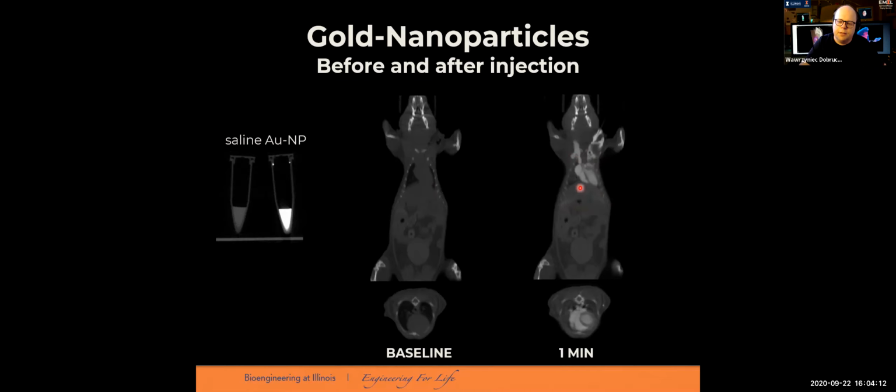blood pool. So that's why you can image the heart, showing the right atria, right ventricle, left ventricle and left atria with a very nice resolution. If you compare this to, for example, a non-contrast baseline imaging, definitely we cannot see any features of the heart.